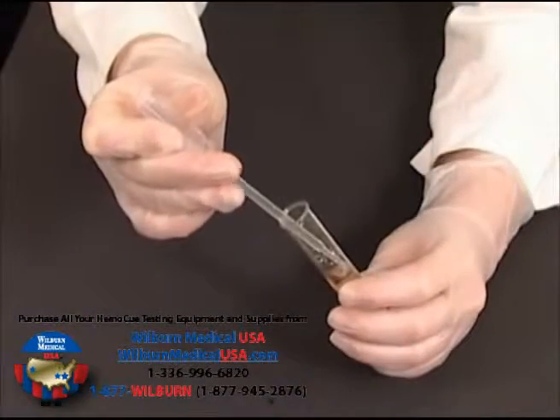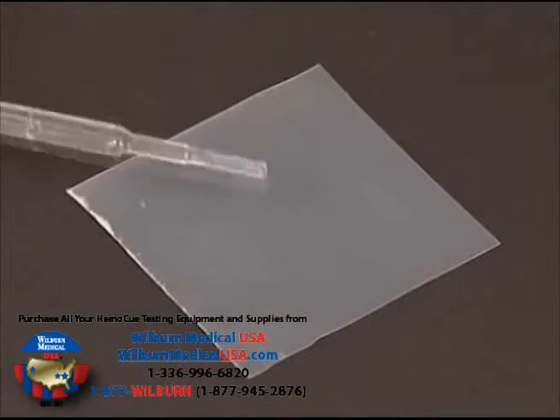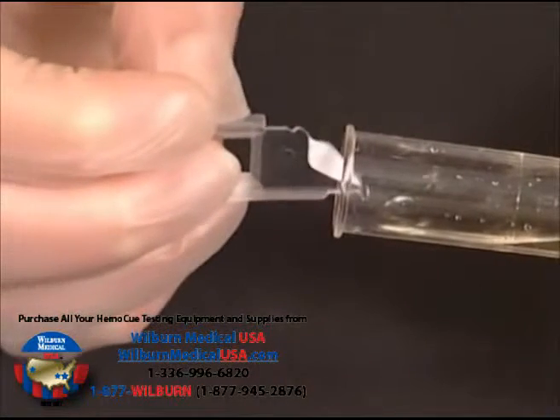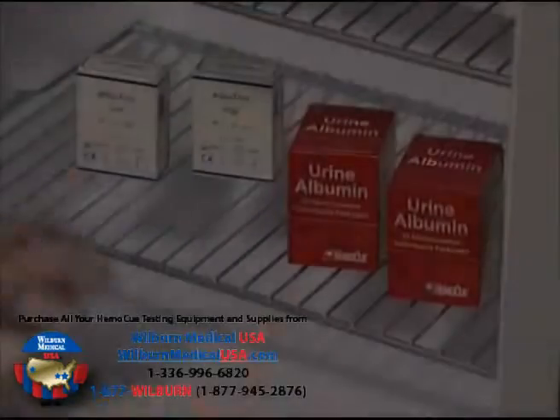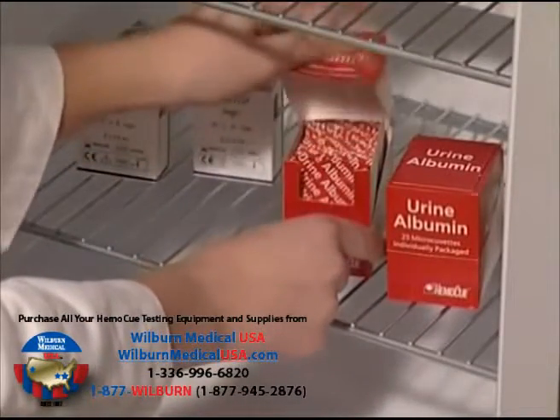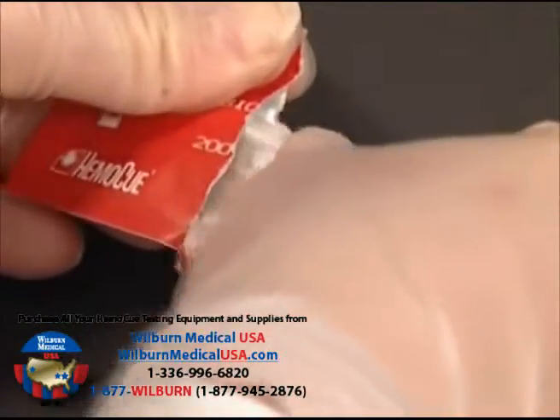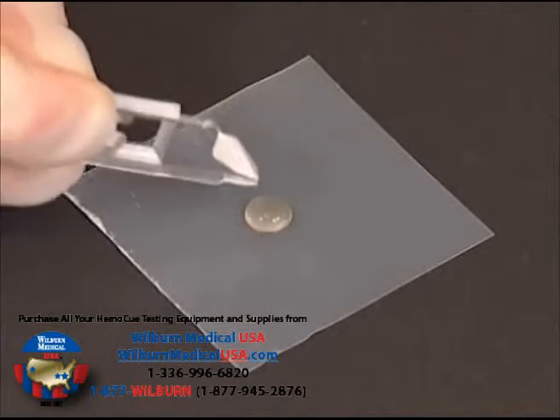Pipette a drop of urine onto a hydrophobic surface, for example, a plastic film. The cuvette may also be filled directly from the sample container, unless the sample is to be used for other analysis. The reagents within the urine albumin microcuvette are moisture and temperature sensitive. Open the package on the back and carefully remove the microcuvette. Use the microcuvette immediately. Hold the cuvette opposite the filling end and bring it into contact with the urine sample.